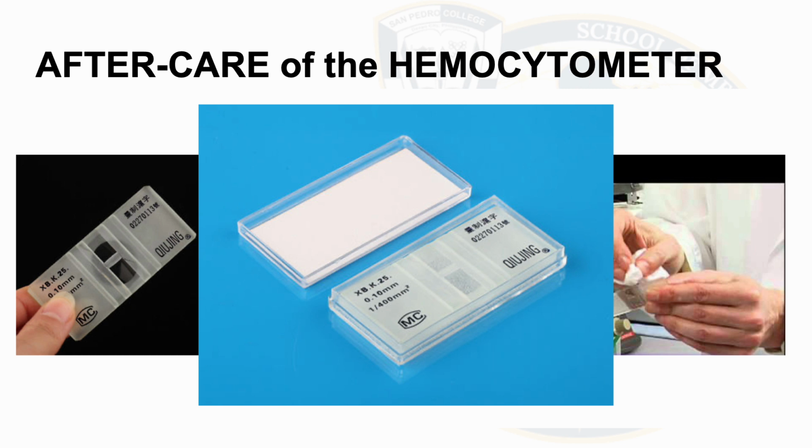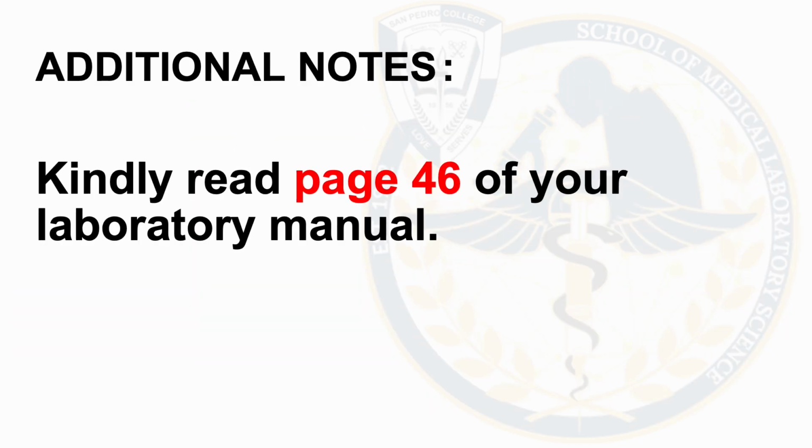Ibig sabihin, what to do if tapos ka na. So, first is clean it with water or if necessary, a mild cleansing solution. So, dry it with soft cloth or rinse it with acetone. Yan ang sinabi ko, acetone. And you don't need to wipe off the acetone kasi mag-evaporate lang yan. Okay? So, lastly, kindly read page 46 of your laboratory manual for additional notes.